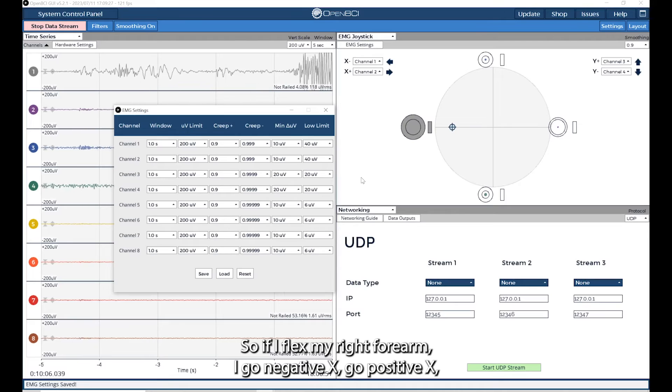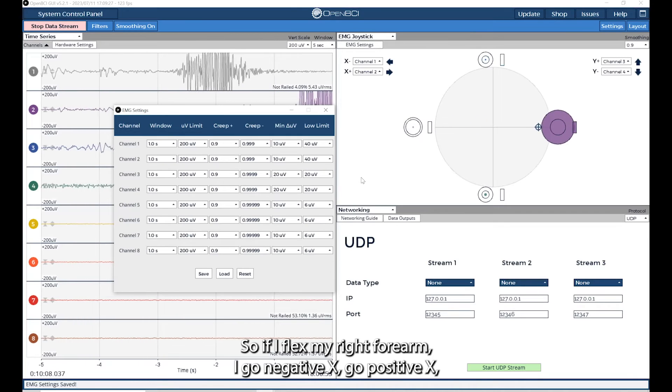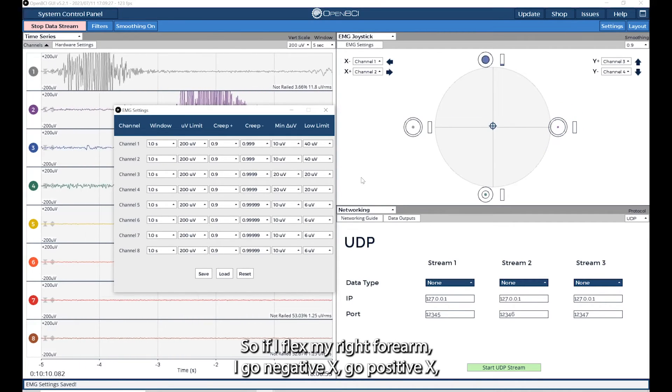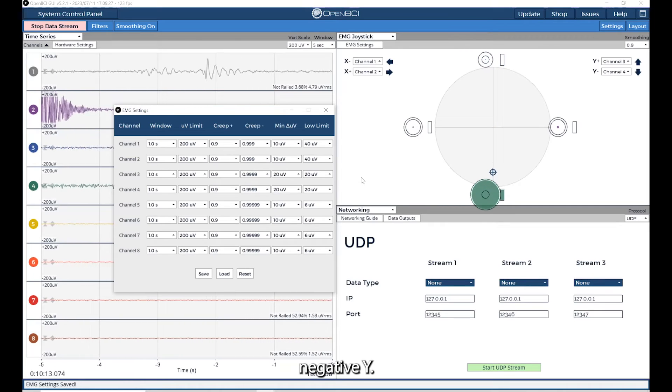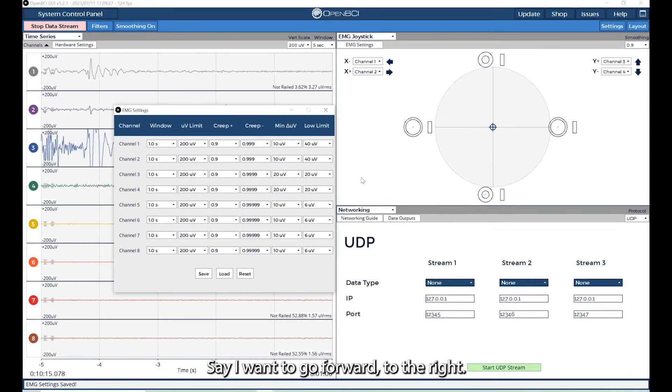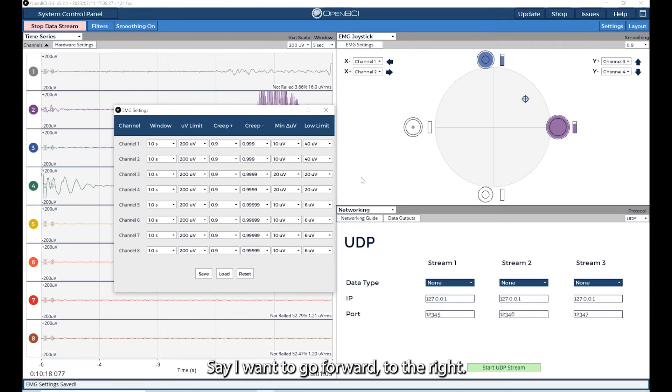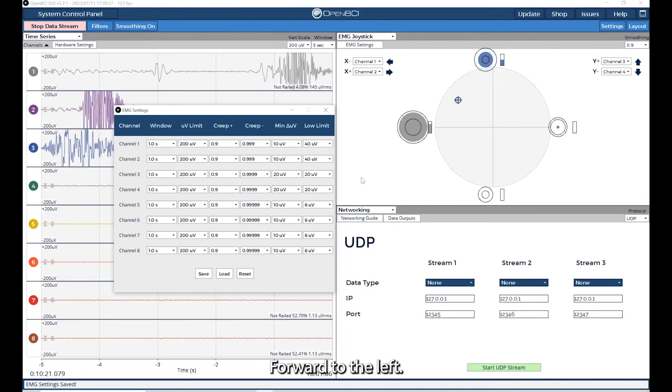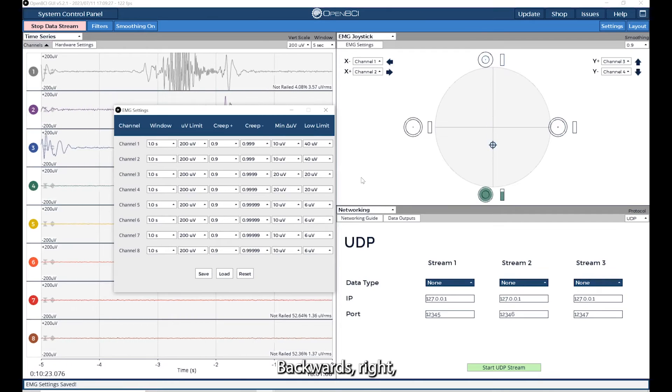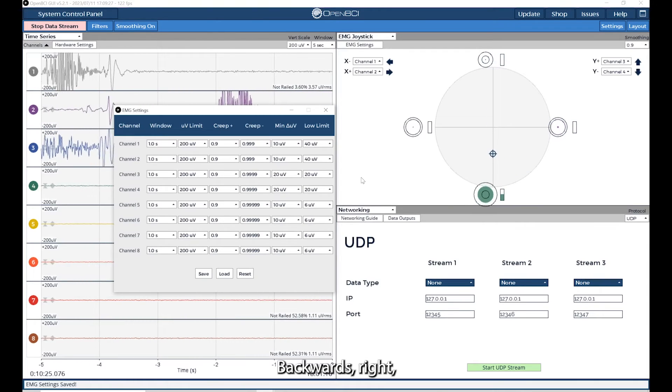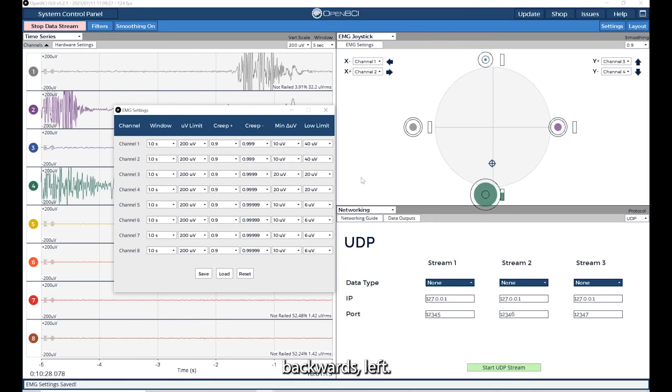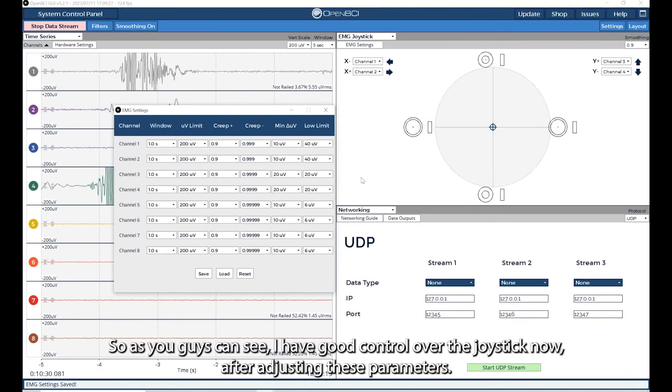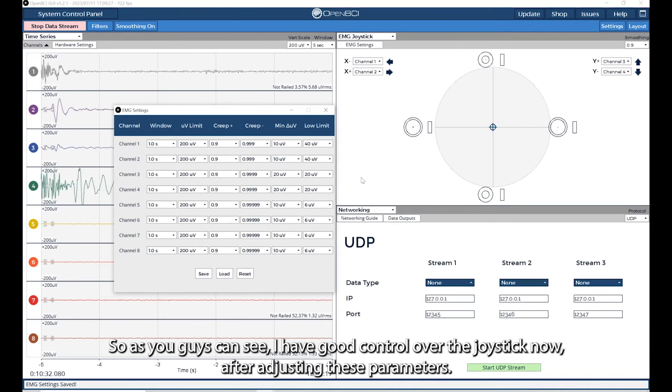Now I can show you how I have better control over the joystick. If I flex my right forearm, go negative x, go positive x, positive y, negative y. Say I want to go forward to the right, forward to the left, backwards right, backwards left. As you can see, I have good control over the joystick now after adjusting these parameters.